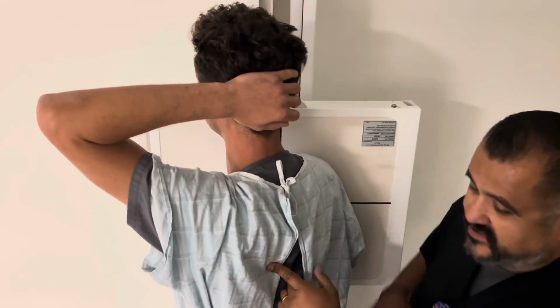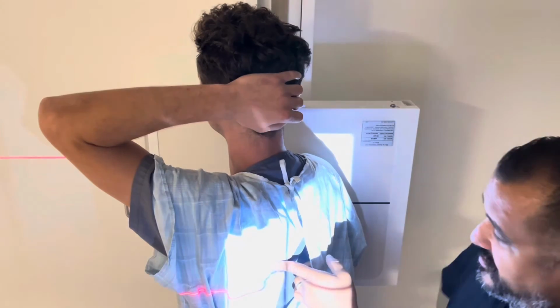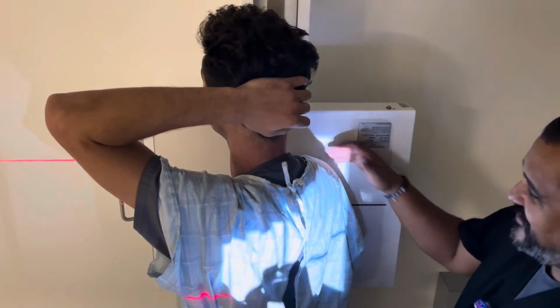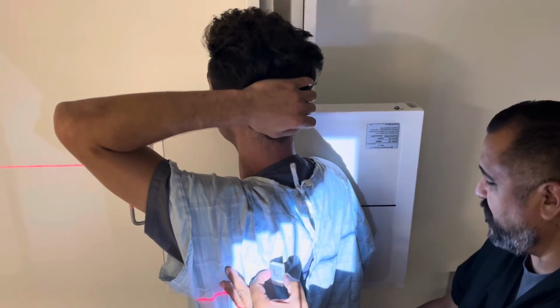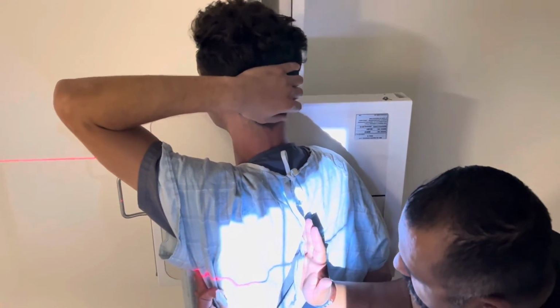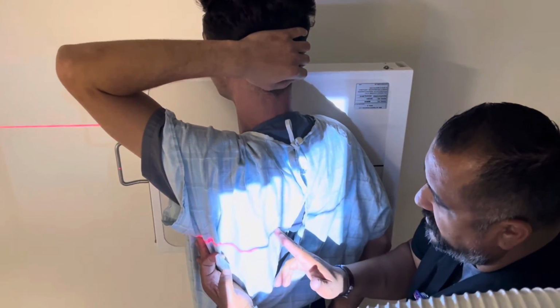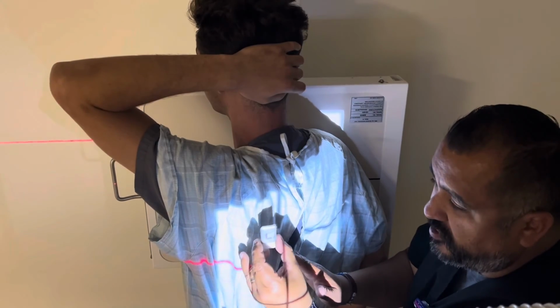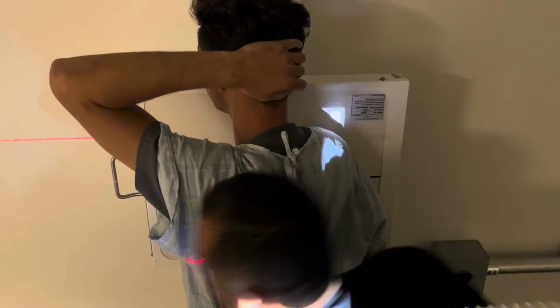I want to try to get the central ray here. All right, so look at that. That's pretty close. That's pretty good, huh? All right, so we got lucky right there. This arm we're going to bend just out of the way a little bit. And again, you have the spine and you have the elevated side. You want to try to get that beam right on the inferior angle of the scapula. I'm going to put my left marker face down, PA on the left side here.